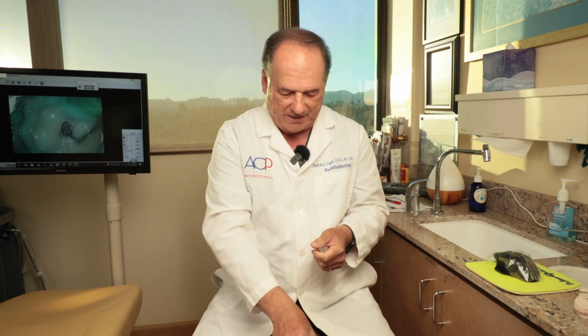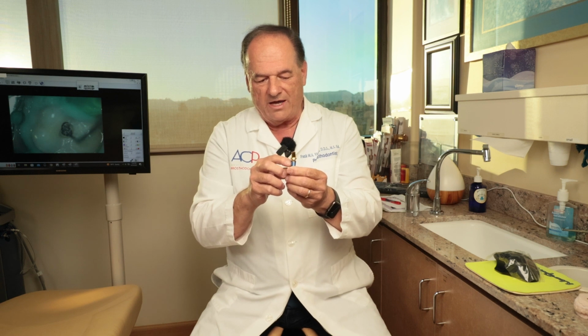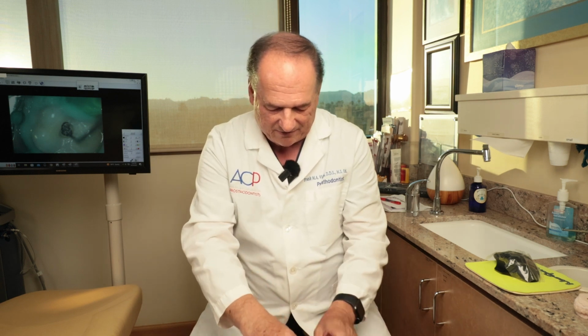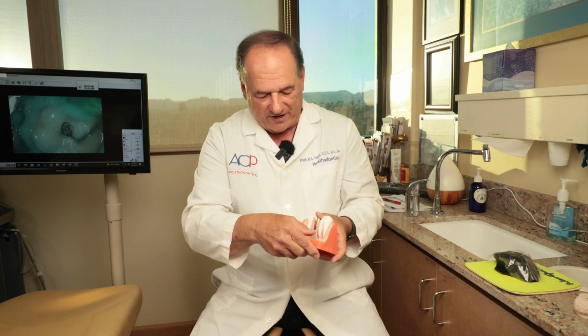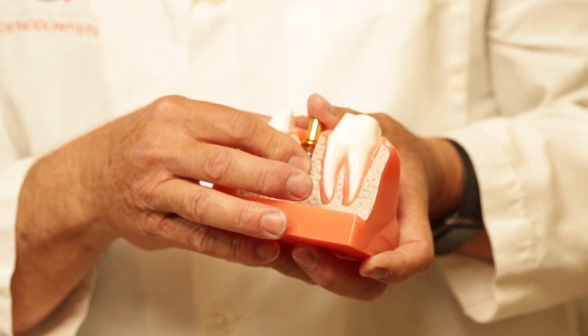With an implant though, as I mentioned before, it's not a tooth. The mechanism of how it stays in your mouth is different than a natural tooth. The same bacteria that can cause problems with your natural teeth can cause the problems around an implant. The only problem is the way you start having infection around the implant itself is a very different process because the bone is connected directly to the implant.